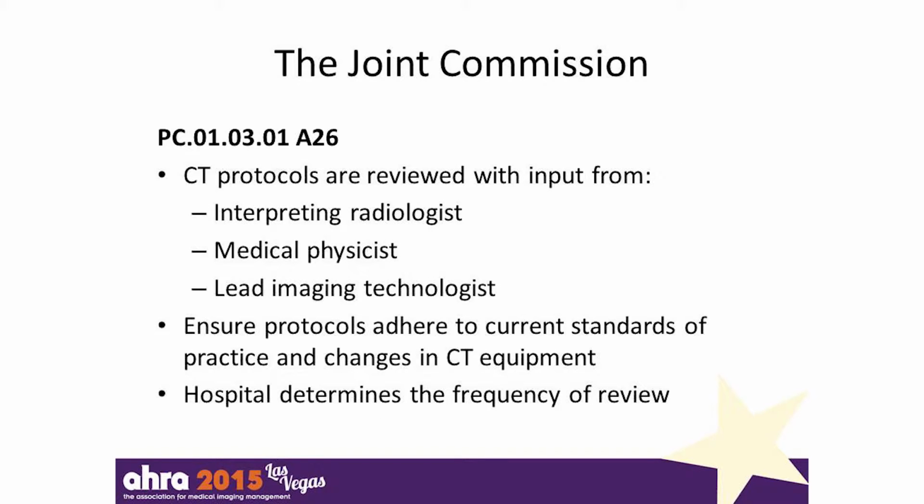The third one is that CT protocols are reviewed with input from an interpreting radiologist, a medical physicist, and a lead imaging technologist. And this review is to ensure that protocols adhere to current standards of practice and changes in CT equipment. The hospital is allowed to determine the frequency of these reviews.